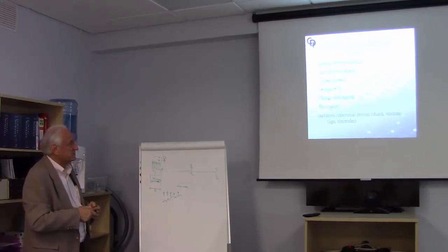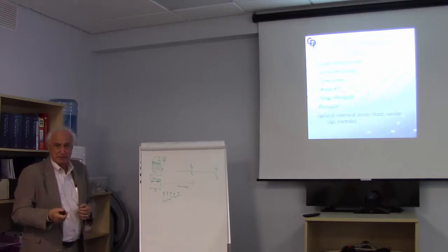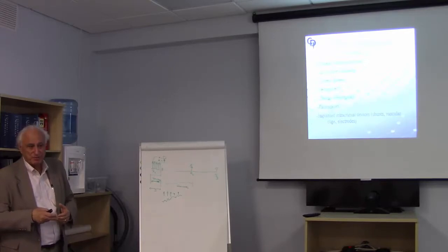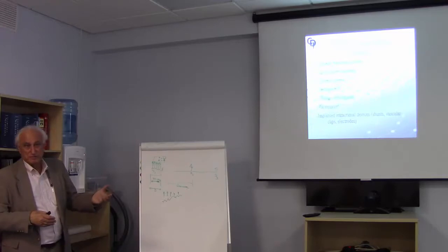Now, pacemakers are a bigger problem because I have seen pacemakers get reset from the currents flowing through the body. So, in general, it may not cause a severe problem, but if you have someone who has a cardiac pacemaker that's pacing their heart at a certain rate, and it gets reset to a lower rate, they're going to go to whatever their baseline rate is without the pacemaker. So you really don't want to do that.